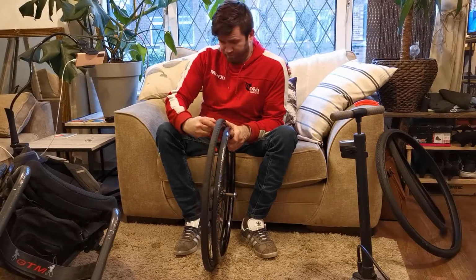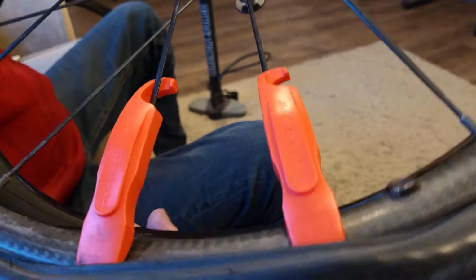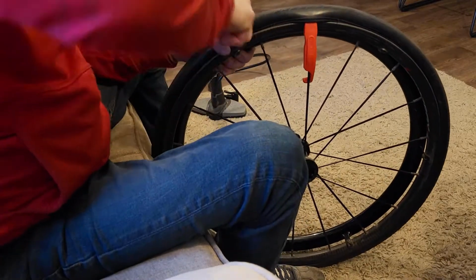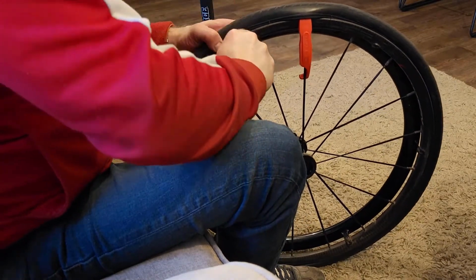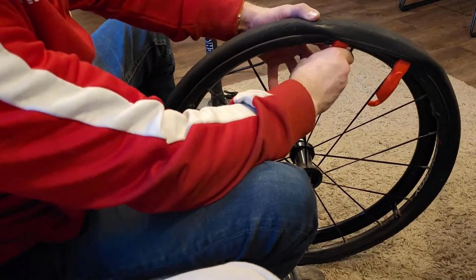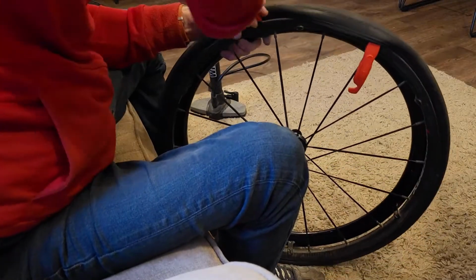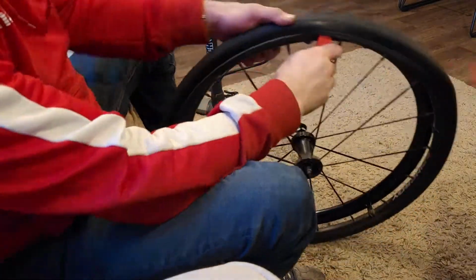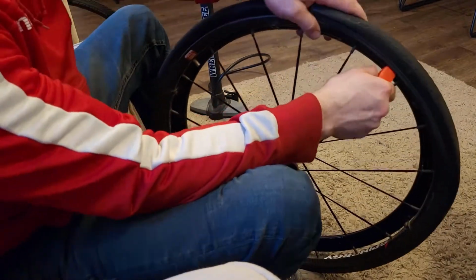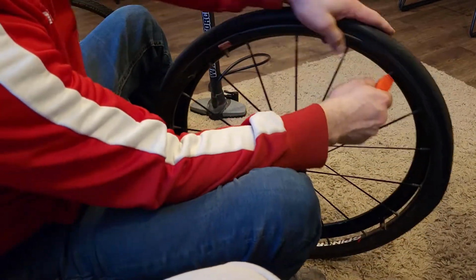Now you do need to get both levers in place before actually hooking it on, otherwise the pressure on the bead is going to be too much and you're not going to be able to get that second lever in. The first time I put them on too close and I wasn't actually able to get a good purchase to get enough of the rim off. And here I've got about 6 or 8 inches, and that enables me to be able to get the lever on.